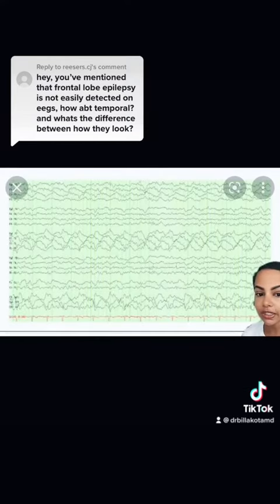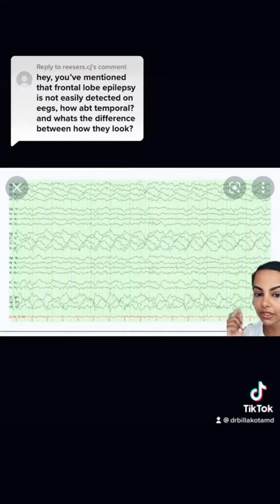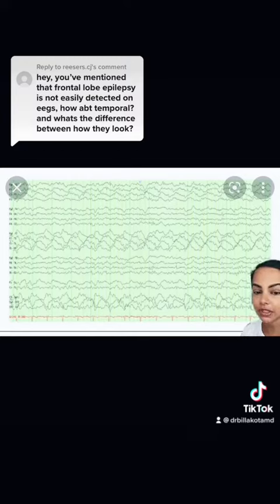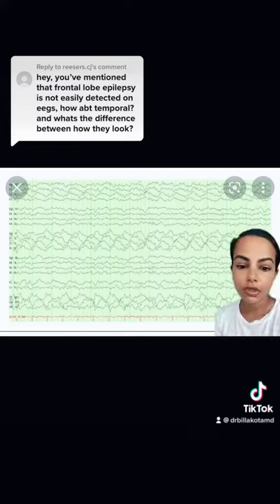In contrast, with temporal lobe epilepsy, you see that nice rhythmicity that's coming from the temporal lobes. Temporal lobe seizures are a lot more visible on EEG, and even in between these seizures, you'll see spikes in the temporal lobe region.